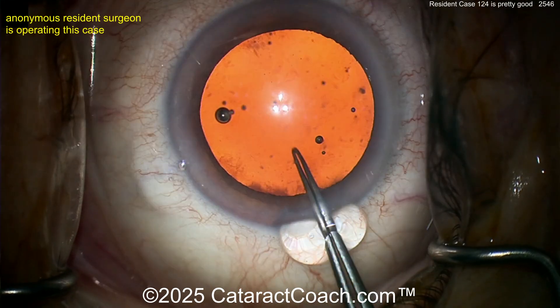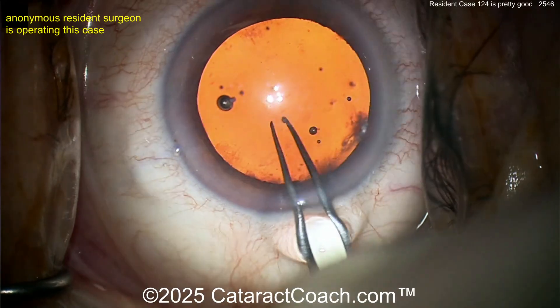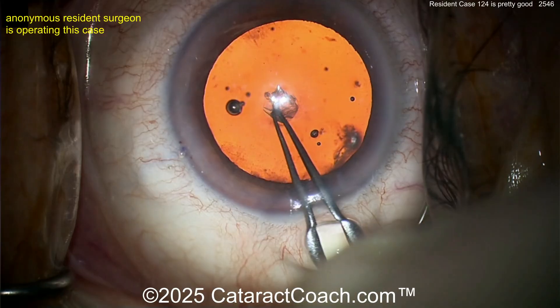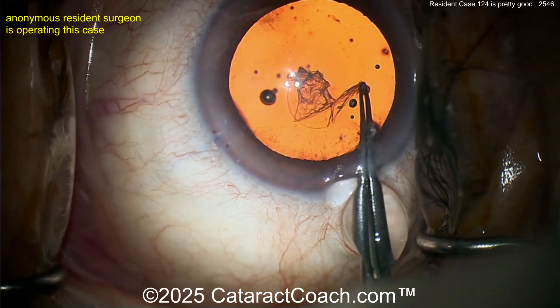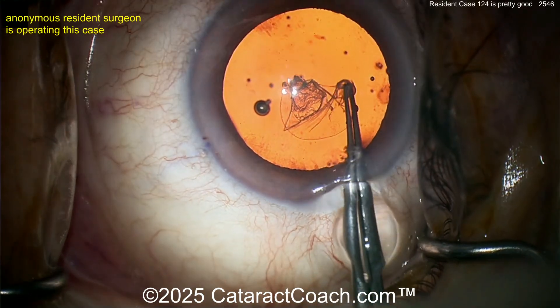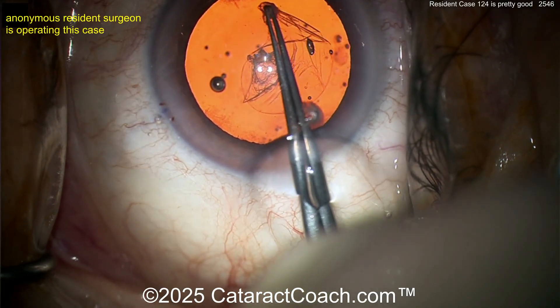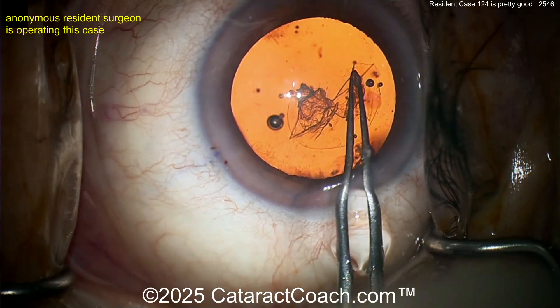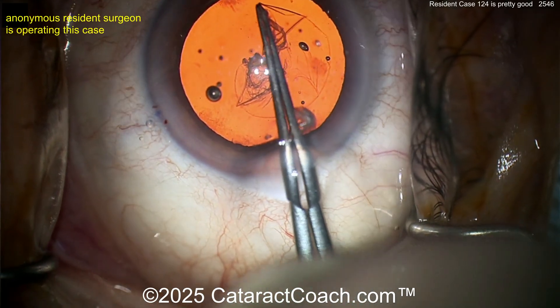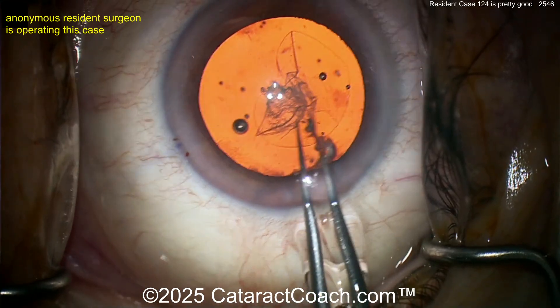Now let's see the capsulorrhexis. I like going in with just the forceps — no cystotome needed. Going in with forceps, poking in the middle, got a flap there. Now flipping it around — I like the technique. Good job floating in the incision. Here comes the rhexis again. It really does take a lot of practice, and you're coming around nicely.